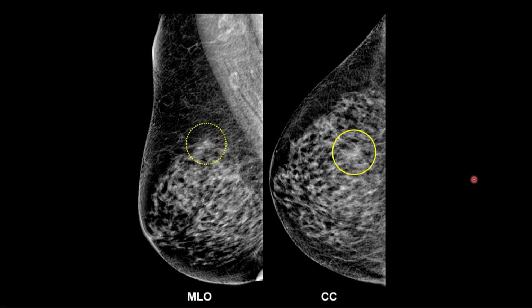And they wind up having to work up multiple areas and not even be confident that they're looking at what you were looking at when you did the recall. And then you get really annoyed at whoever did that because they forgot to put the annotation on, and you go back and look at the report to see who you're going to chew out, and you notice that it was you. So always annotate and save the annotations. Don't let them go away.